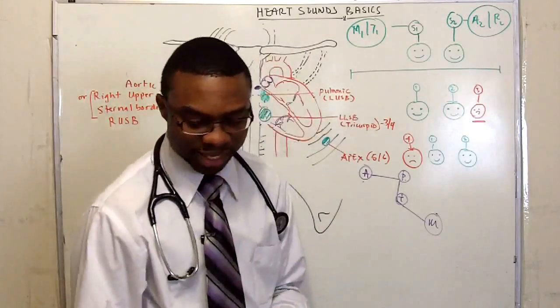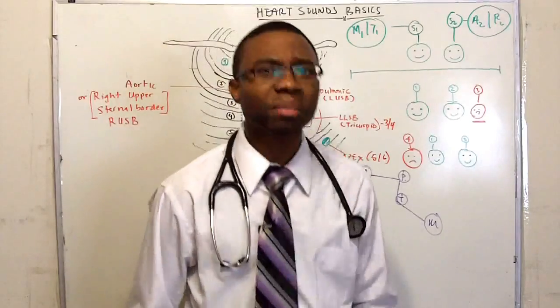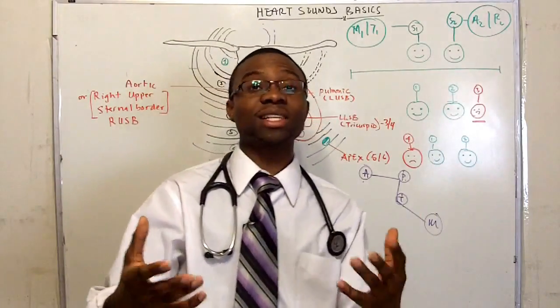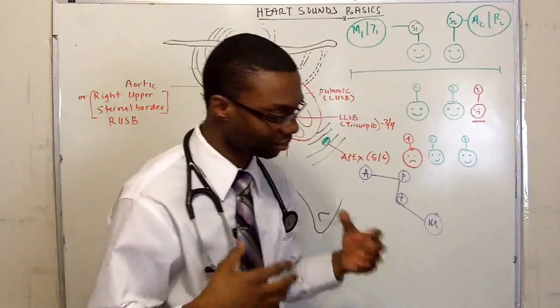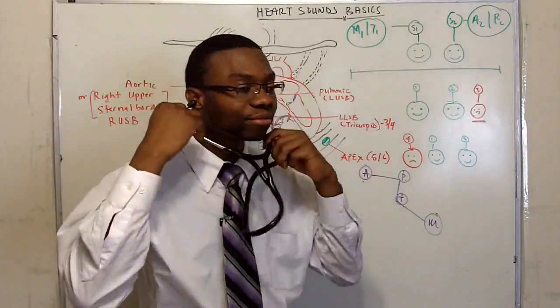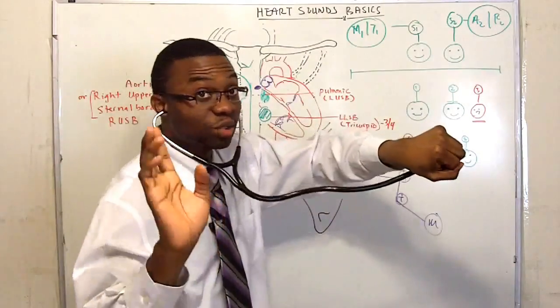So most people say Kentucky. You know what? I've said Kentucky for so long, I never remember it because I don't know what I'm listening to. So my attending, Dr. Scott, said, this is how you hear S3. You put on your stethoscope, just like that. We place this in our hands, and this is 1, 2 again.